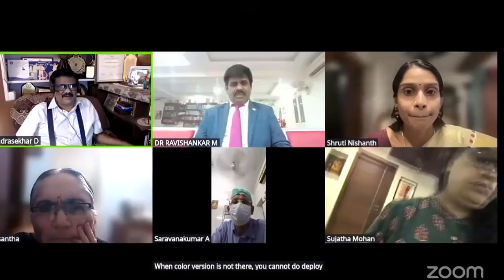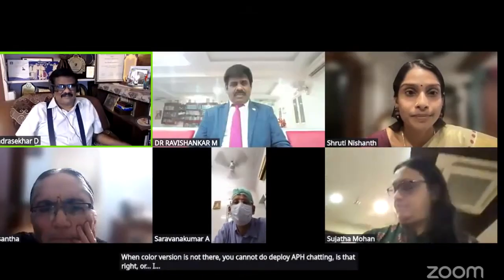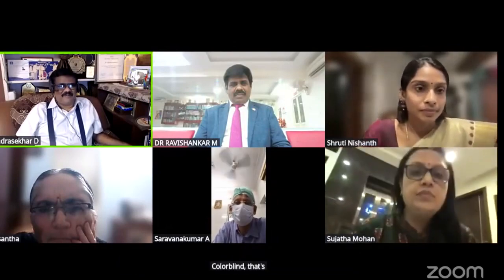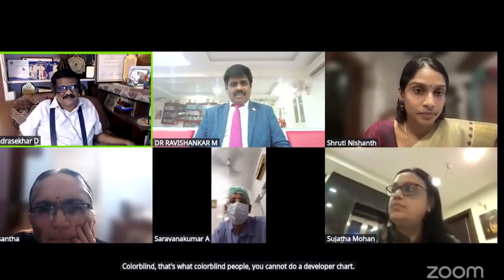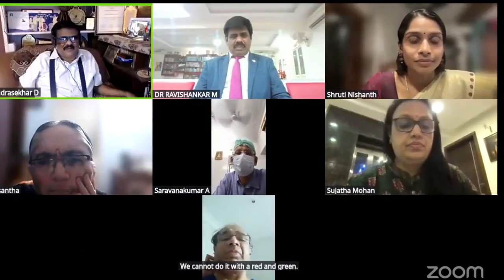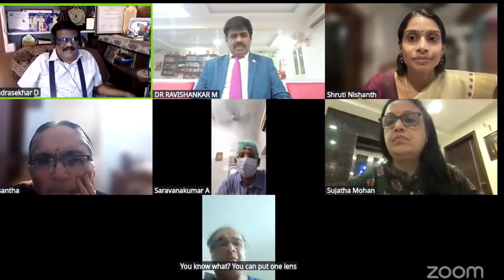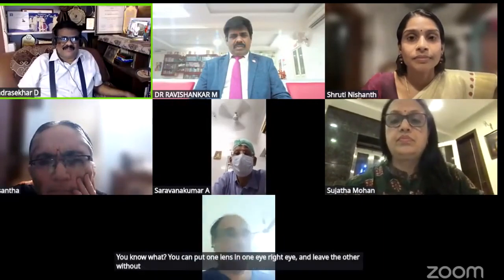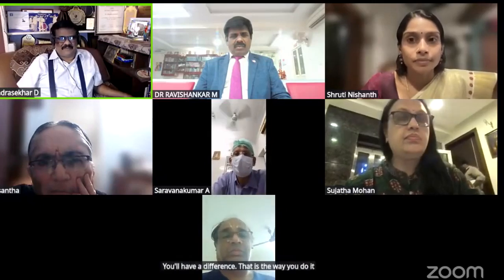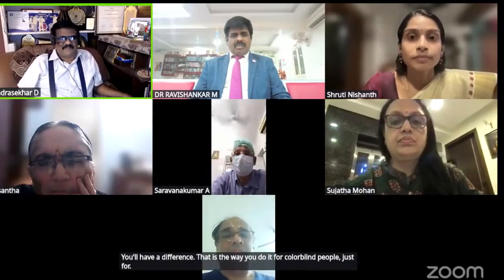Only one thing you told is when color vision is not there, you cannot do diplopia charting. Is that right? Colorblind people, you cannot do a diplopia chart. We cannot do it with the red and green. You know what? You can put one lens in one eye, the right eye, and leave the other without a lens. You will have a difference. That is the way you do it for colorblind people. Just for the benefit of everybody, I thought I'll add.